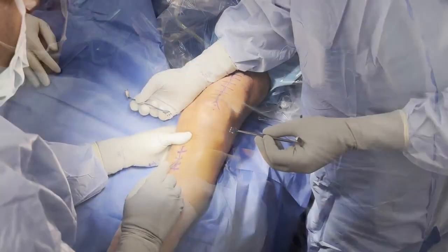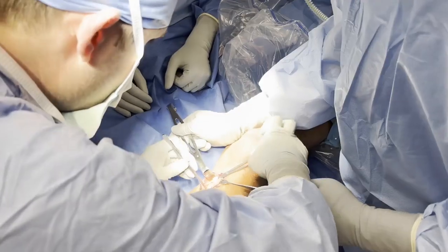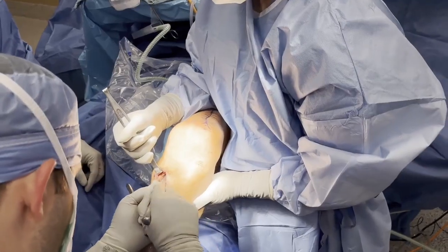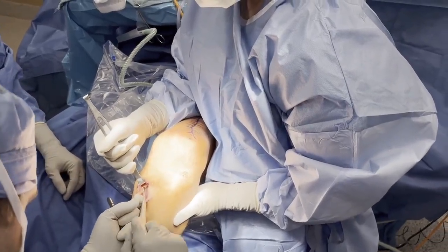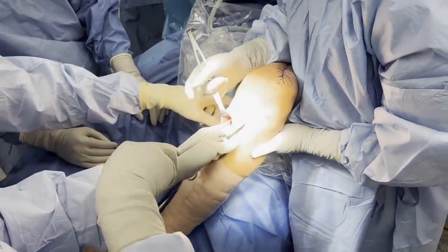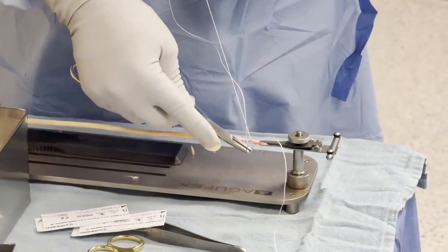An incision is created over the anterior medial aspect of the tibia, over the pes anserine tendons, and carried down until the semitendinosus tendon is identified. Any adhesions attached to the semitendinosus tendon are then removed with a cobb elevator. The semitendinosus tendon is then harvested with an open hamstring harvester and prepared to fit through a 4.5mm diameter tunnel.